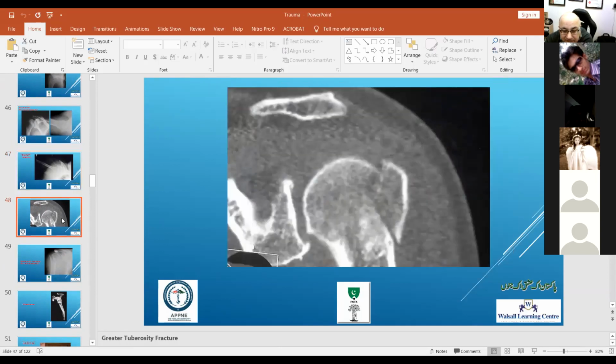Like, what is this? This is a right-hand dominant gentleman with a fracture of the proximal humerus. What do you see? It's showing a greater tuberosity avulsion fracture. And what type of fracture would the nearest classification be? I think it's 1. What, sorry? It can't be one part. There's no one bone broken. There are two. Always a minimum of two. Two parts, sorry. Three parts. Perfect. Yeah, three parts.